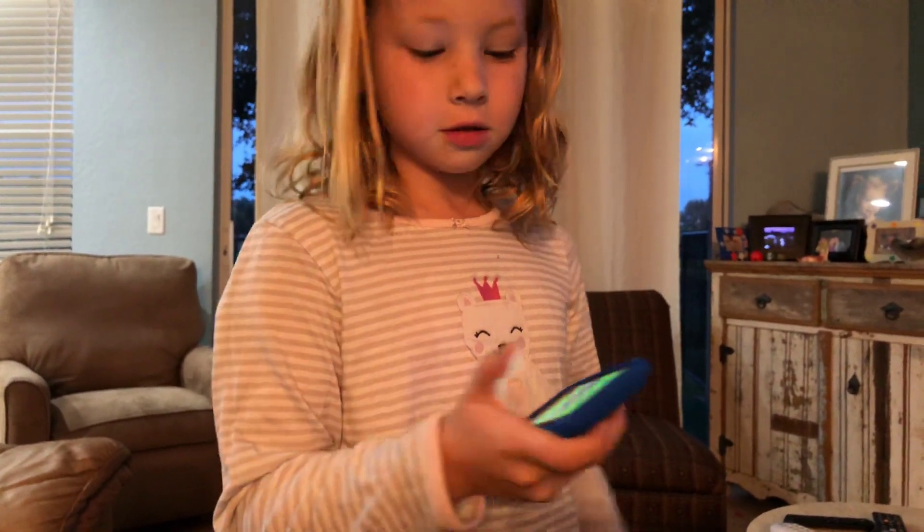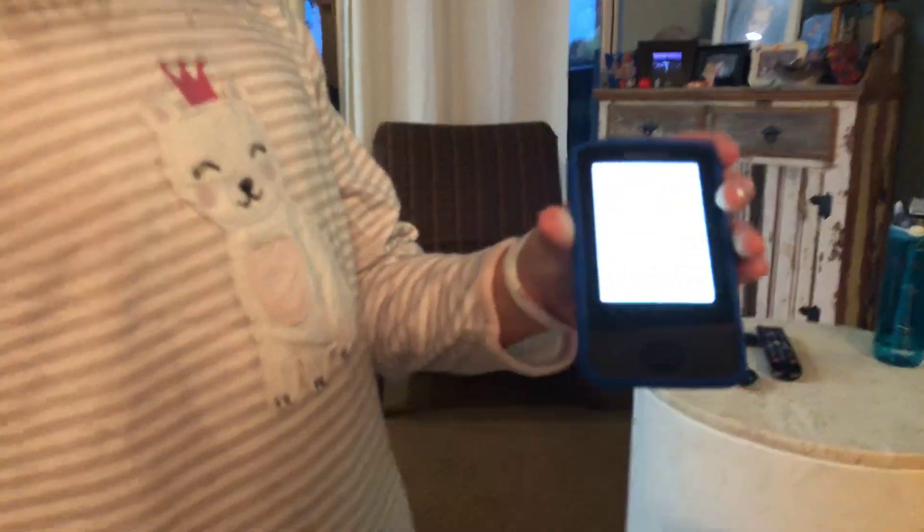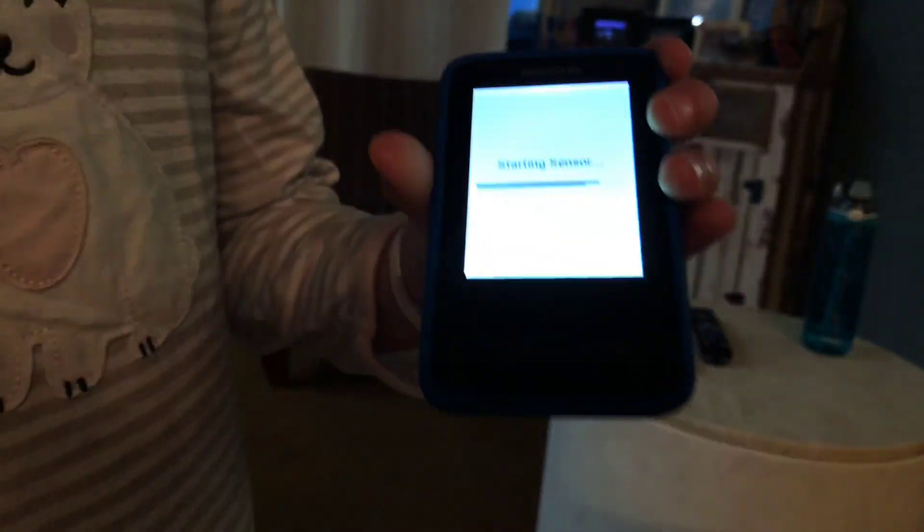Now we start the sensor. You hit start sensor, one, two, and then it starts the sensor. You wait two hours and then you're good.